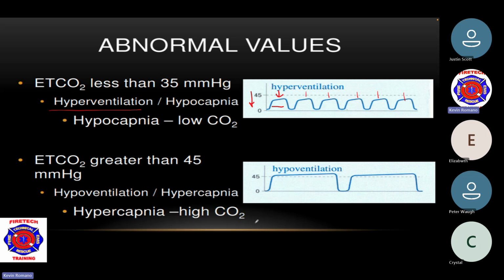Eventually that will come back down again. You just have to give it time. Don't start treating that right away and say, oh my God, we need to hyperventilate this patient. Breathe normal. The body just came out of a cardiac arrest for 20 minutes. Give it a minute to normalize. It can't happen that quick.